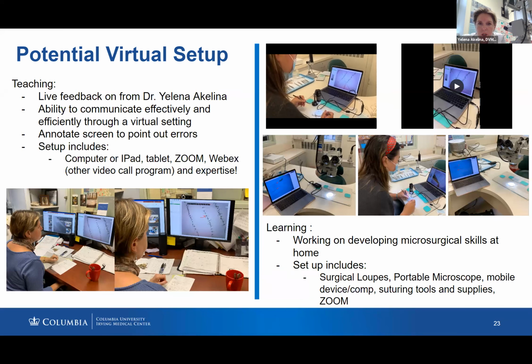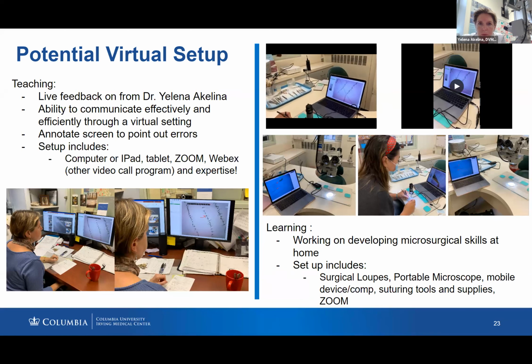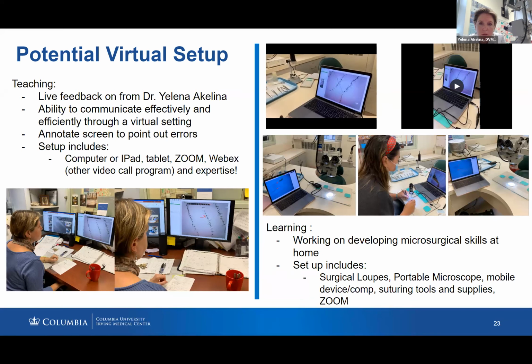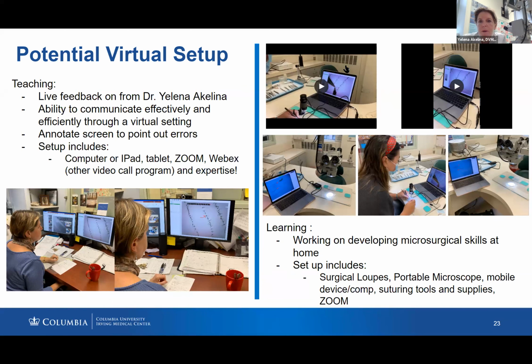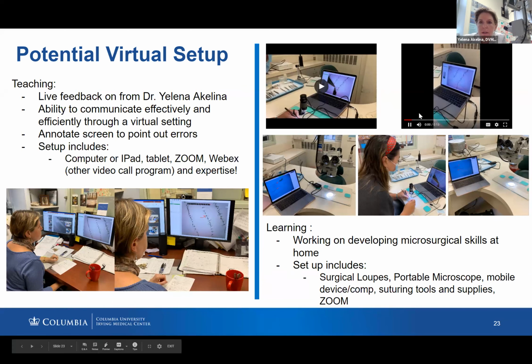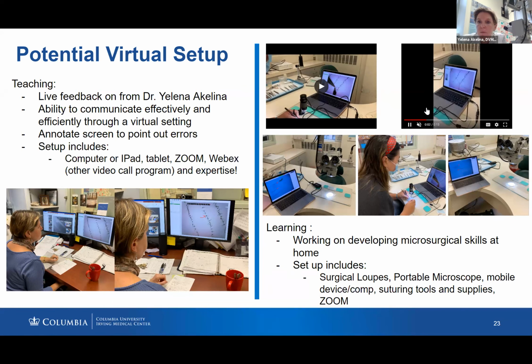And what she's doing, she's putting stitches on the microscope, looking through the tablet, through the iPad, or laptop. And the laptop connects through the Wi-Fi. It connects to Zoom, so she can actually Zoom with this live, and I can look.